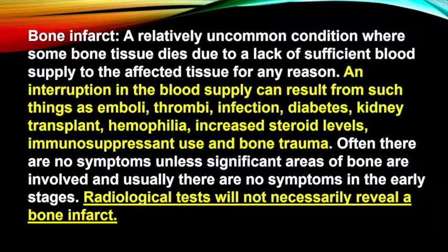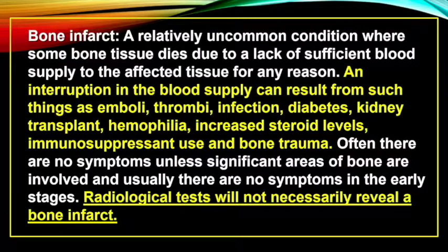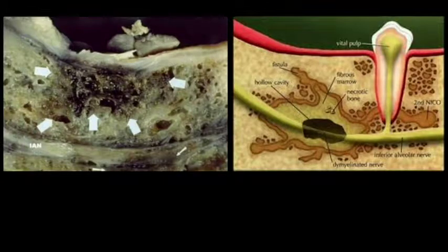And this is where I'm coming from. I may be at odds with Dr. Lechner in some areas, but I don't go in and treat them. I have the luxury of just being the guy that looks for occult pathology in your scans and then makes you refer somebody when there's an appropriate finding that needs referral. So I went through, and I've been doing, it's like going down a rabbit hole, guys. I'm sorry, I appreciate what you're doing. I would not go there at this stage of my career. I'd much rather look at the images and help you determine whether or not you should treat.